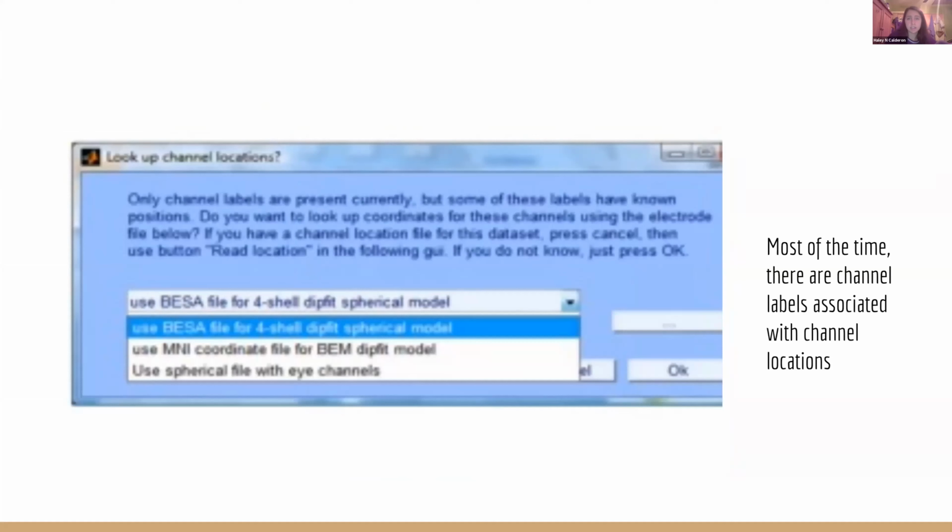I think yours is just going to already be in the MNI coordinate system. EEG Lab did highly recommend that people use MNI, so I think they eventually made that a standard, but don't quote me on that. If you want to try it, let me know, and I'll troubleshoot it.